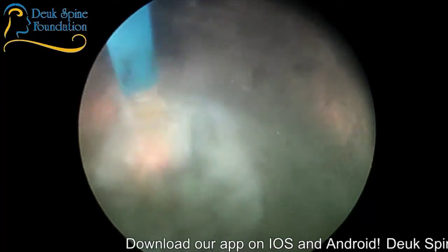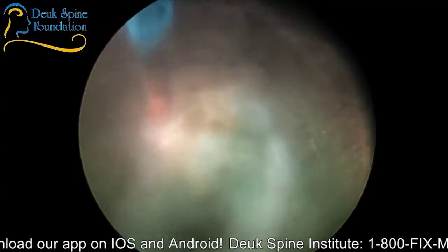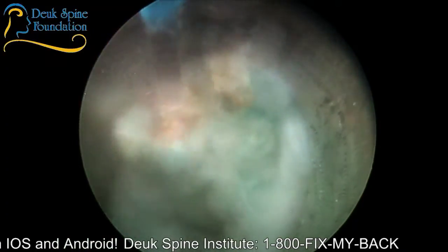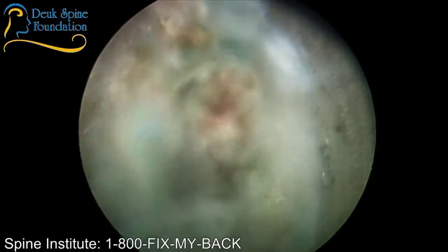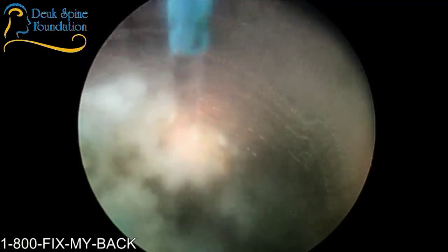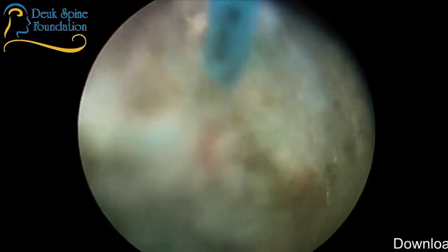But you can see the tear. It's the blue line. Right here is the tear. And all that golden color stuff is calcium, calcification of the tear. And the reason why the tear calcifies is your body responds automatically, naturally to chronic inflammation by laying down calcium deposits. It's called dystrophic calcification. And anytime the body has abnormal tissue, diseased tissue, you can lay down calcium in a process called dystrophic calcification. And so that's why we're getting that golden color.